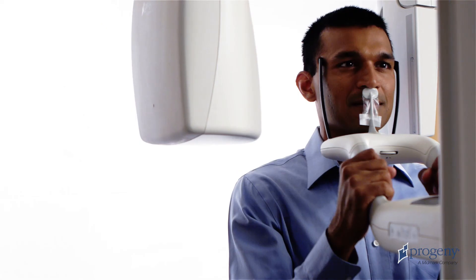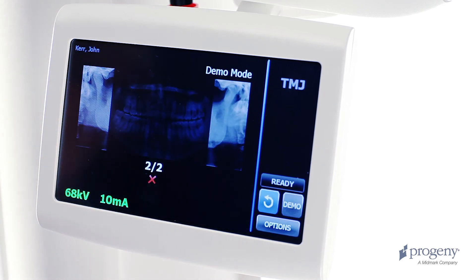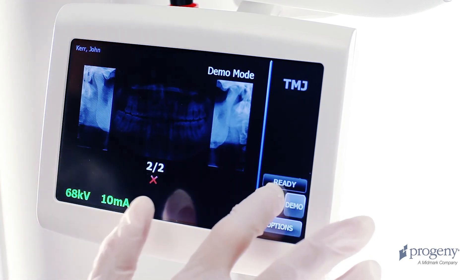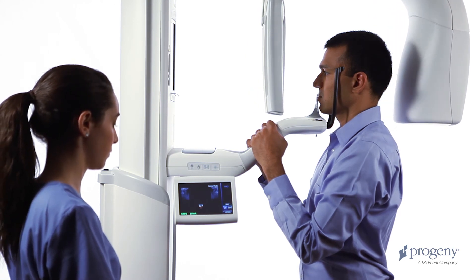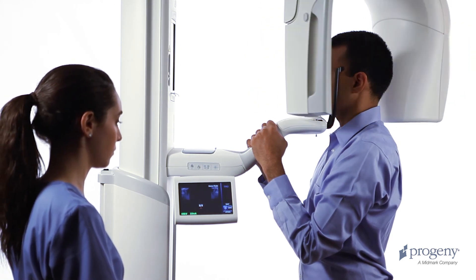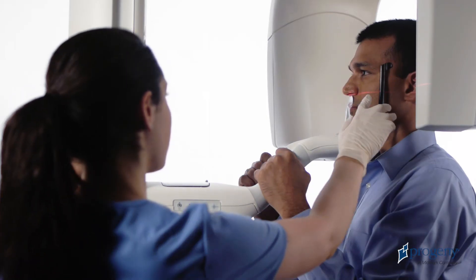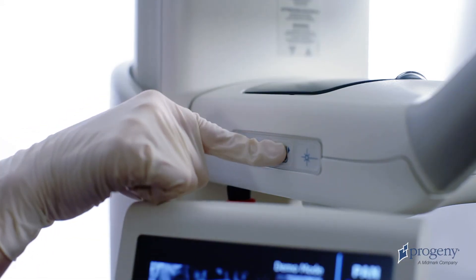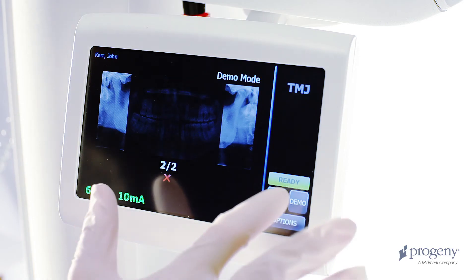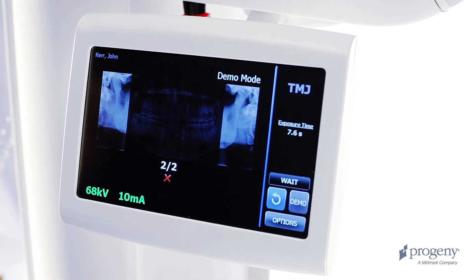Verify the first TMJ scan on the Vantage Touch display and press OK. While the patient remains in place, return the overhead structure to the patient entry position. Once this movement is complete, realign the patient's Frankfurt plane, mid-sagittal line, and close the temple support wands. Again, enter the ready for imaging position by tapping the cycle button once and verify the green ready condition.